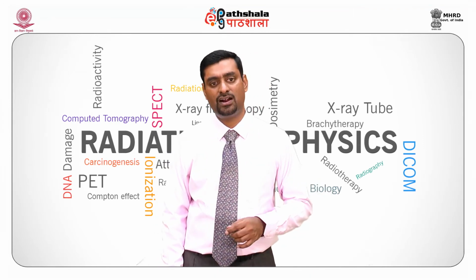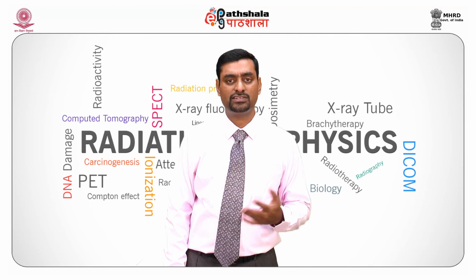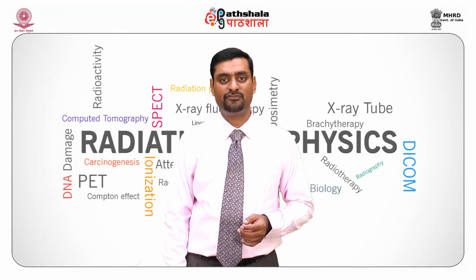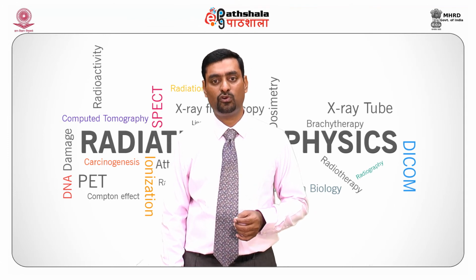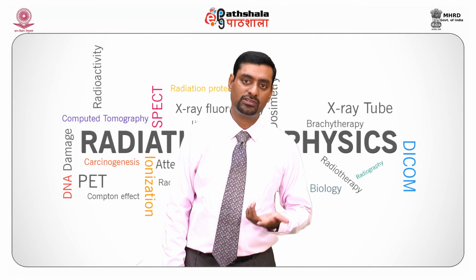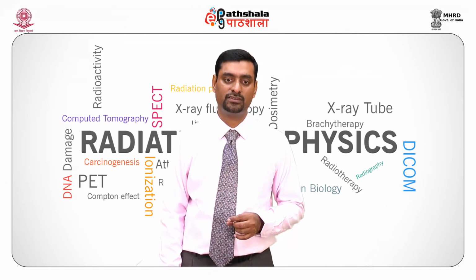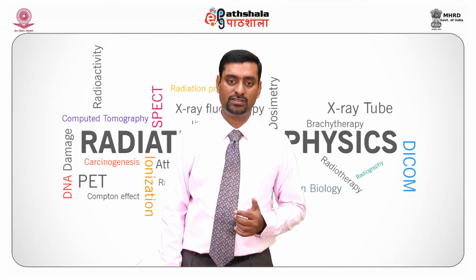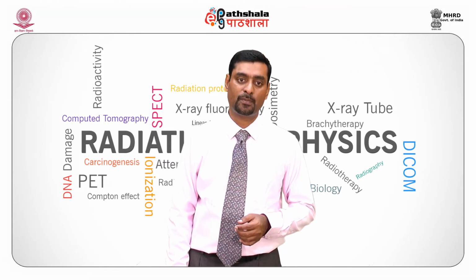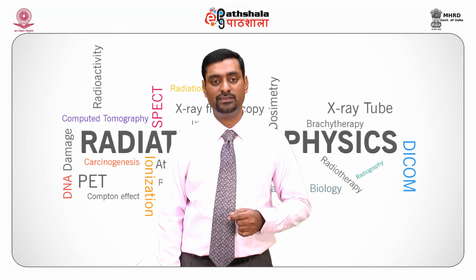Fixer also has hardening agents. The function of the hardener is to reduce the drying time and prevent physical damage. Aluminum chloride and aluminum sulfate are commonly used hardening agents. It also has a preservative such as sodium sulfite, used as a preservative to retard the decomposition of thiosulfates. There are also anti-sludging agents.